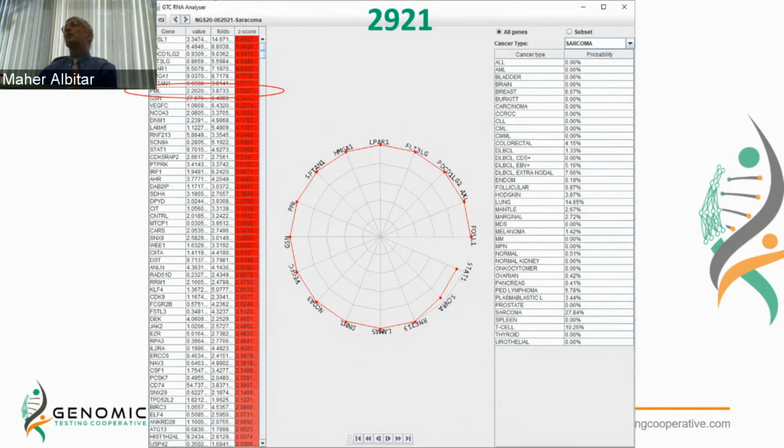Currently we are lumping all the sarcomas together, but as we collect more cases, we are going to have more subclassifications of the sarcomas, but we need more cases to be collected in our database. So the artificial intelligence software will be trained to call it as such. So this is, again, progress in improving this AI software. Next slide.